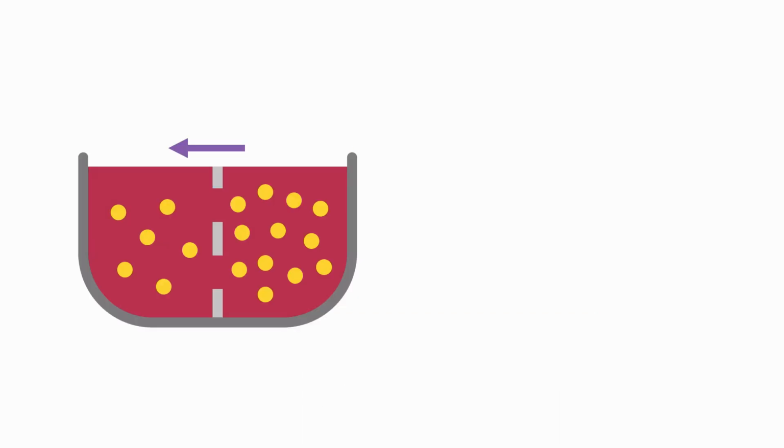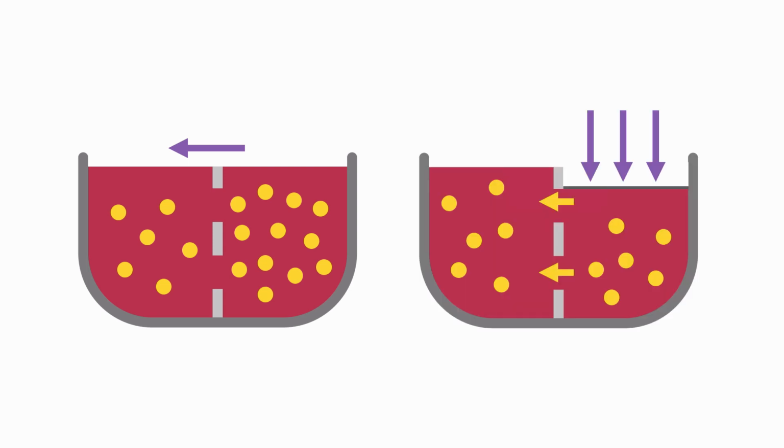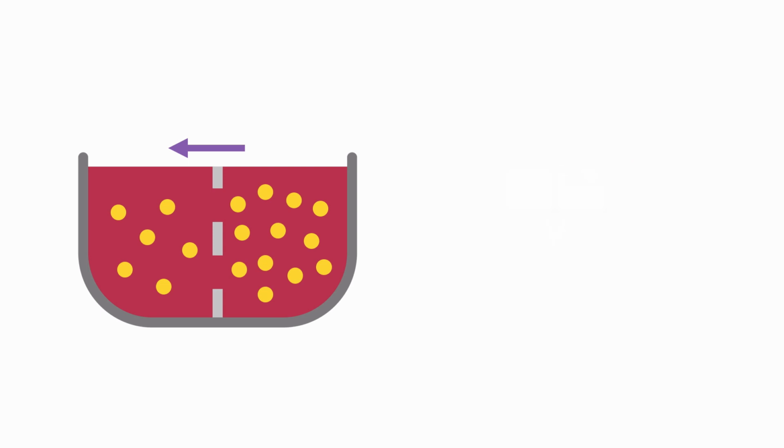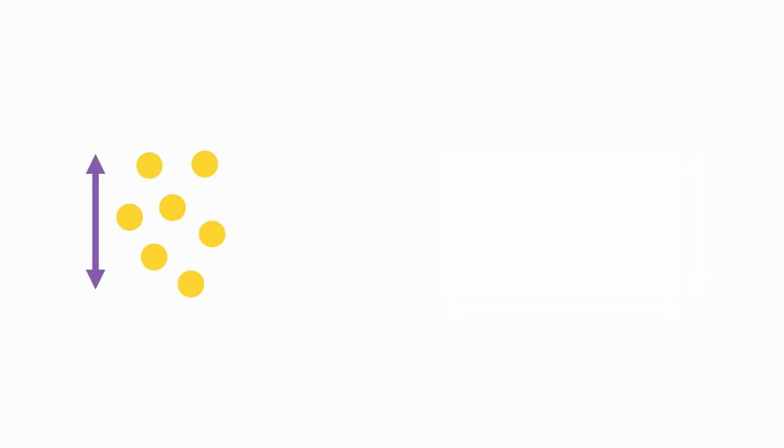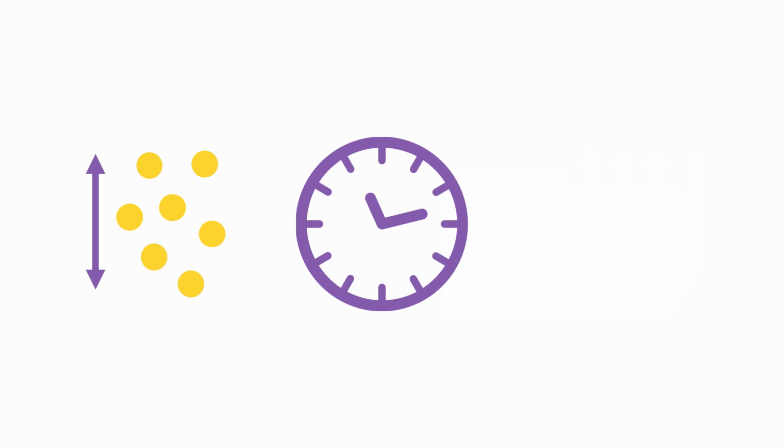Similar to hemodialysis, the movement of water and solutes occurs by 2 processes: diffusion and convection. Diffusion is the main mechanism of small solute transport in peritoneal dialysis. Diffusion is dependent on peritoneal membrane surface area, the solute concentration gradient between the blood and the dialysate, the dwell time of the dialysate in the peritoneal cavity, and the dialysate flow rate.